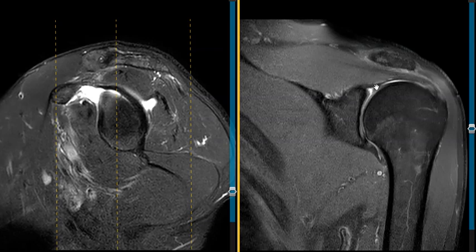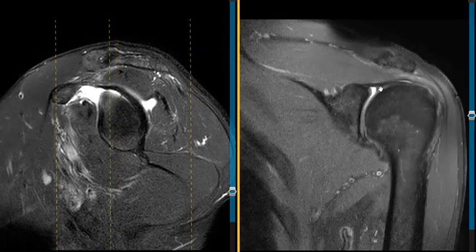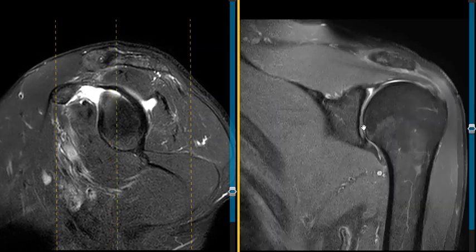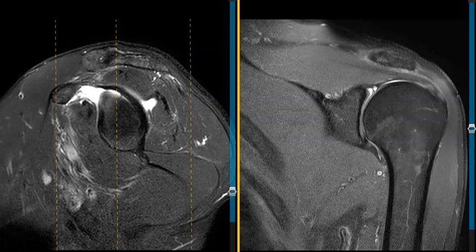Right here is the labrum — the superior labrum and this is the inferior labrum. You can see how the inferior labrum is a little black triangle closely approximated to the bone, but the superior labrum looks like it is torn off by the periosteum and elevated, and there's some fluid undercutting.